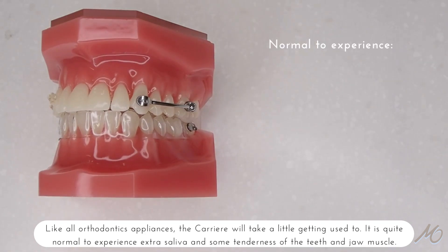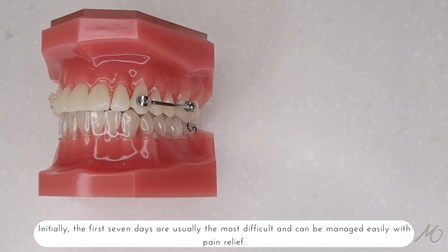Like all orthodontic appliances, the Carriere will take a little getting used to. It's quite normal to experience extra saliva and some tenderness of the teeth and jaw. Initially, the first seven days are usually the most difficult and can be managed easily with pain relief.